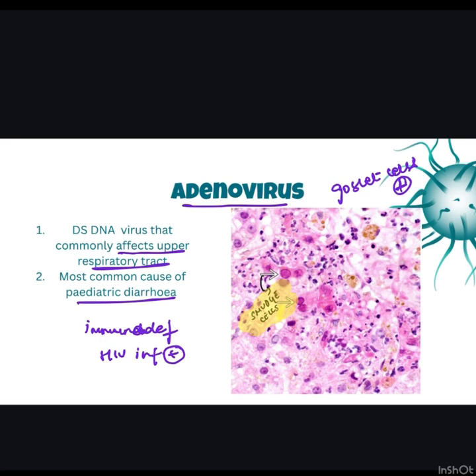They are usually enlarged and homogeneous. They have eosinophilic to amphophilic nuclear halos. They are called smudge cells because of smudgy basophilic enlarged nuclei.